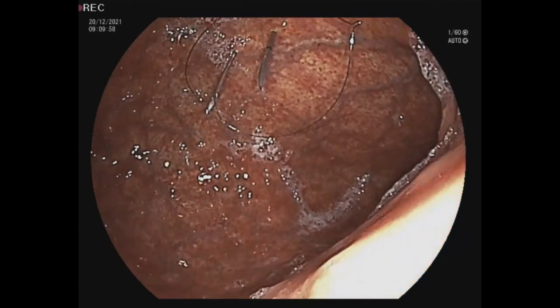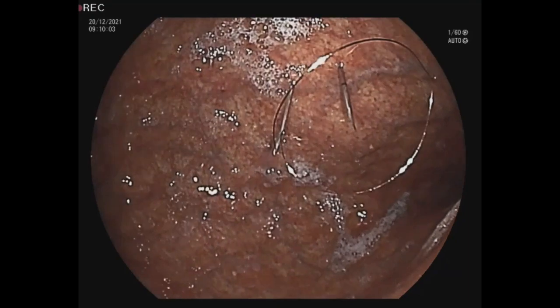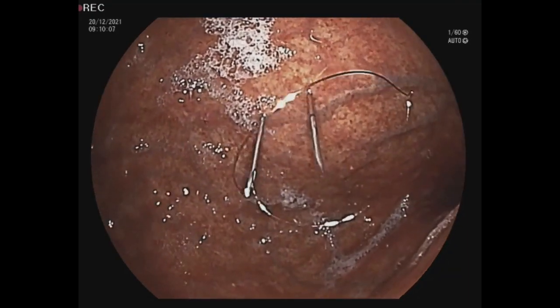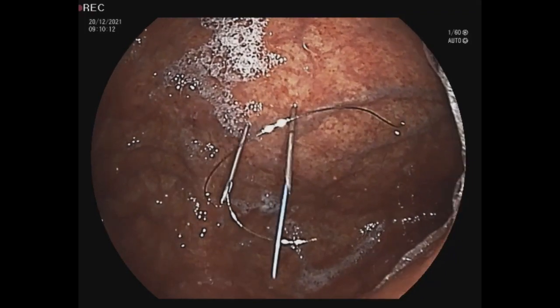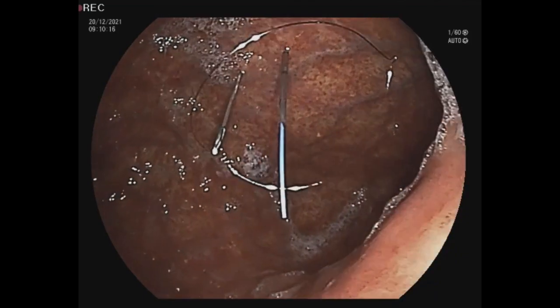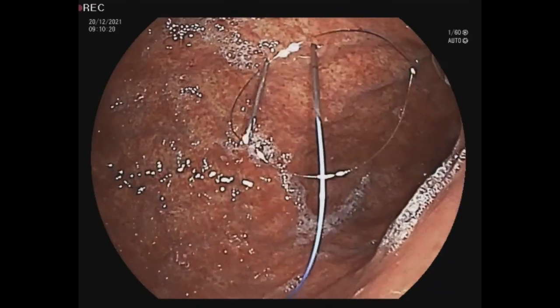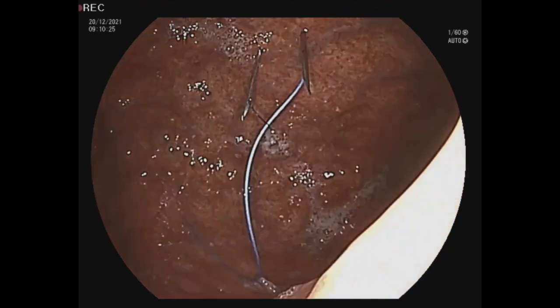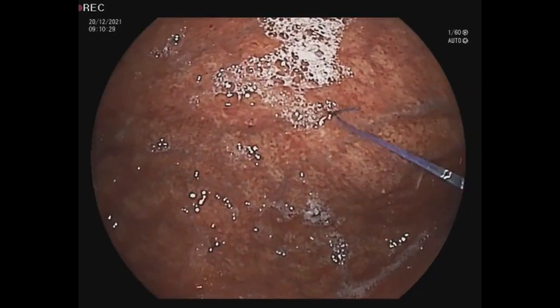In this situation you can see how we make the gastropexy. Now you will see how we use the wire — we catch the wire with the metallic part through the needle and we make the gastropexy.